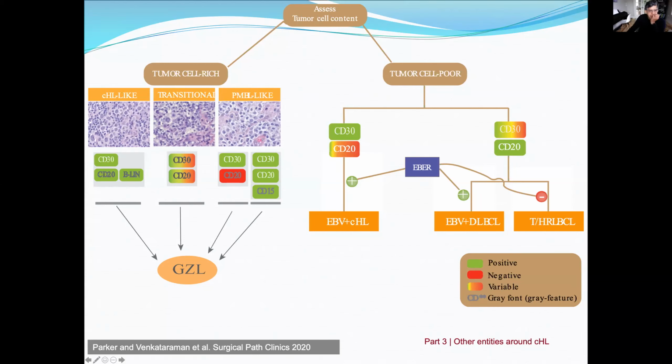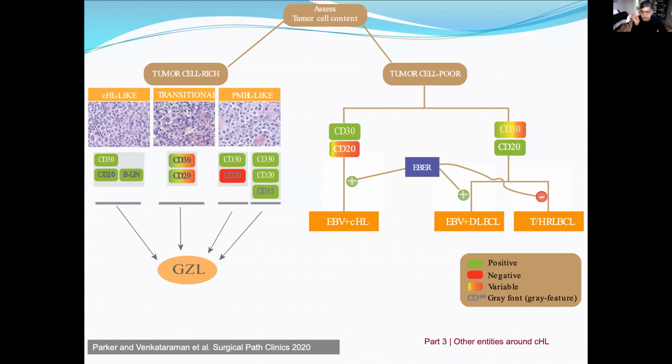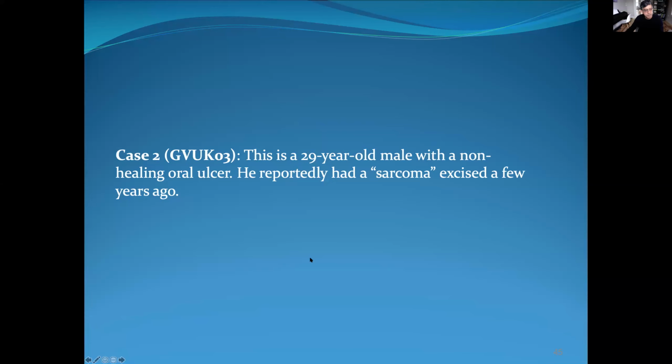So I'll share this paper with you guys later, so you don't really need to make a note. With that said, do any of you have any specific questions related to this area before we go on to our unknown slides? Okay, if there are no questions, you can always email me if you have specific questions relating to pathology. But let's go to the unknown slides. I hopefully have enough time. Yeah, I'm good on time.